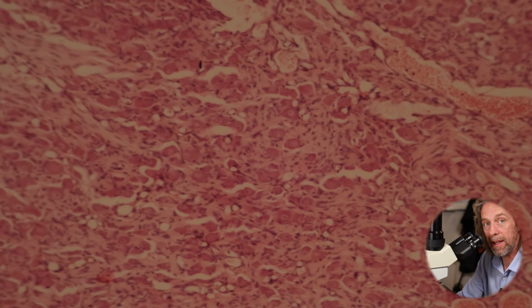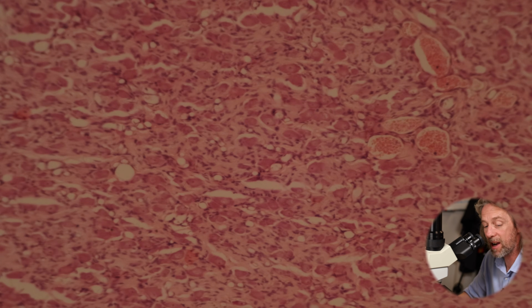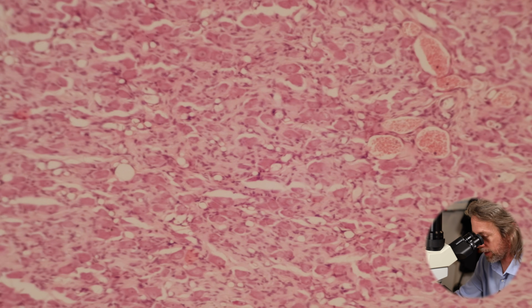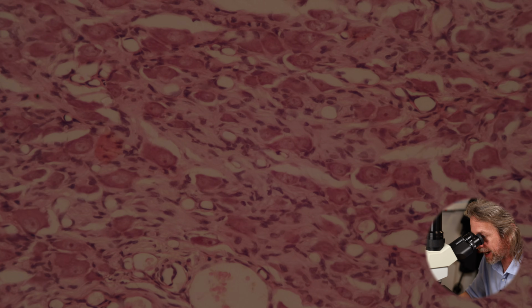But that's what we're looking at here. We are looking at the sympathetic ganglion, so we are looking at the postganglionic sympathetic neuron cell bodies. I know, it's a lot of words, but this is what we're talking about. So this is why it's making a lump, because these things are so much bigger than those tiny axons.